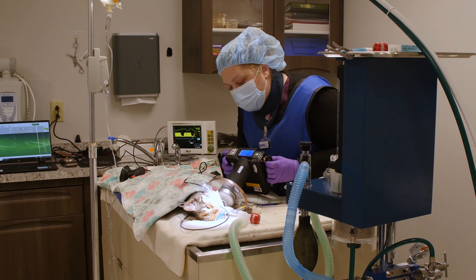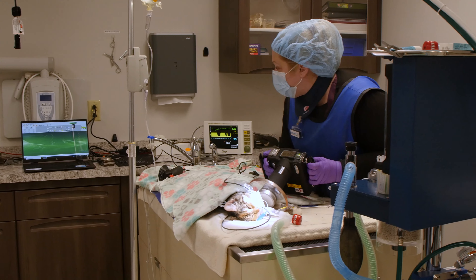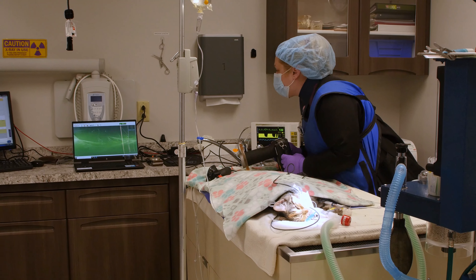Dental radiographs are performed to let us know what's going on below the gum line. If extractions are needed, we will place a dental nerve block. The nerve block is essential for oral extractions — it provides a basis of pain management by blocking the nerve by the tooth that needs to be extracted.